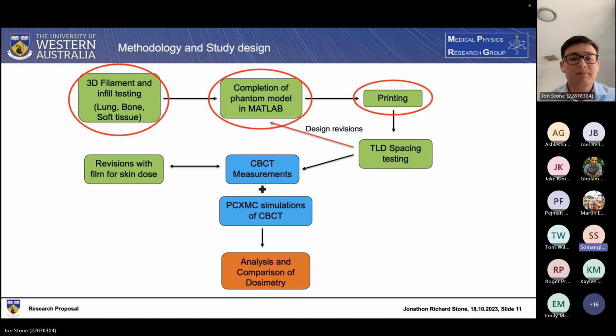Okay. And clarify for me, we use this phantom once Rick runs the software on one of the phantoms, but this software doesn't account for our CBCT. We have a bow tie filter and all these things. I remember that it doesn't account for it. Is it correct? Yeah, I don't think the PCXMC software itself can account for it, but using AutoCalc scripting and a couple of other things, we can, because I read some studies where they actually did verification with bow tie filters using PCXMC. Right. Good to know about it. Thank you. Yeah, thanks.